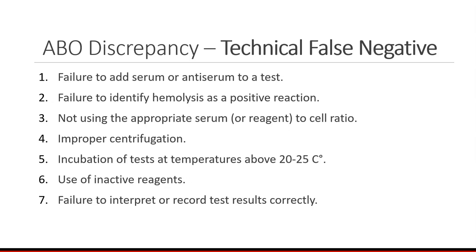I've had students that didn't. They relied on their memory and they got it wrong and potentially could have killed somebody. So you hold the tubes after you've gently shaken them off the button, and you hold them in front of your worksheet and look at the reaction and then record your results. I've been in the field over 35 years. I will never, ever put the tubes away, then record my reactions. In fact, if an inspector came and saw you do that, your lab fails their inspection.